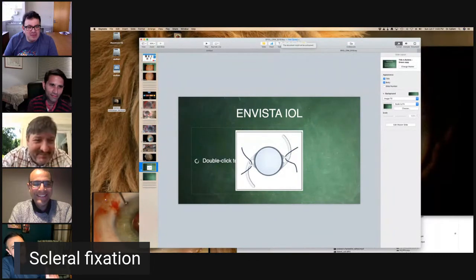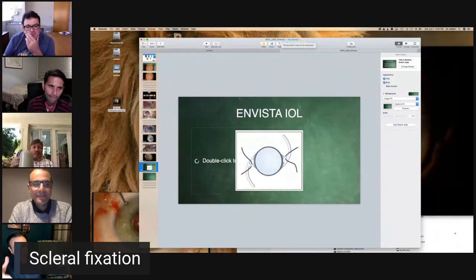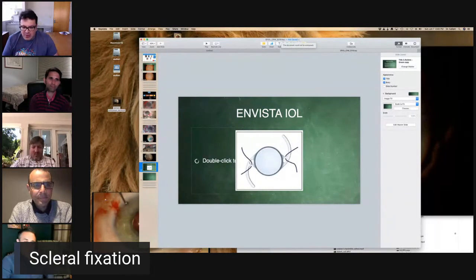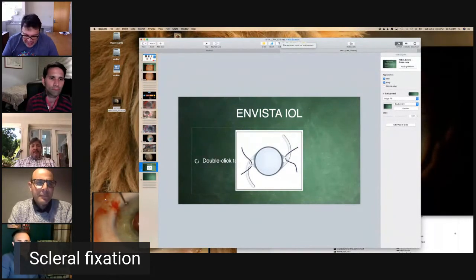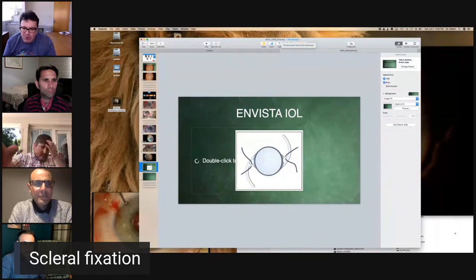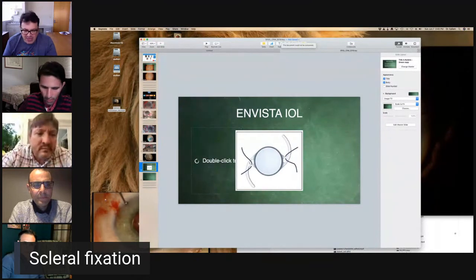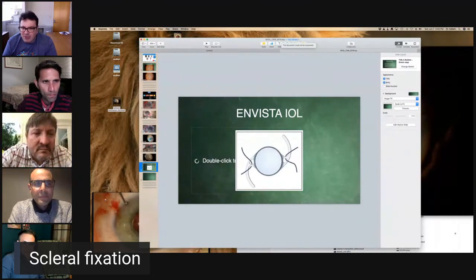I am a bit worried, Ahmed, with the 2-point fixation as well and the tilting of that lens backwards and forwards. That's my feeling. I used to work for someone, the late Rob Johnson, who used to do loads of scleral fixation, and we stopped because of all these tilts. Then I came back with the Acris, and I really love it because of the 4-point fixation. So my worry is still it's a 2-point fixation. Hopefully they can get an Acris-like lens, but hydrophobic.